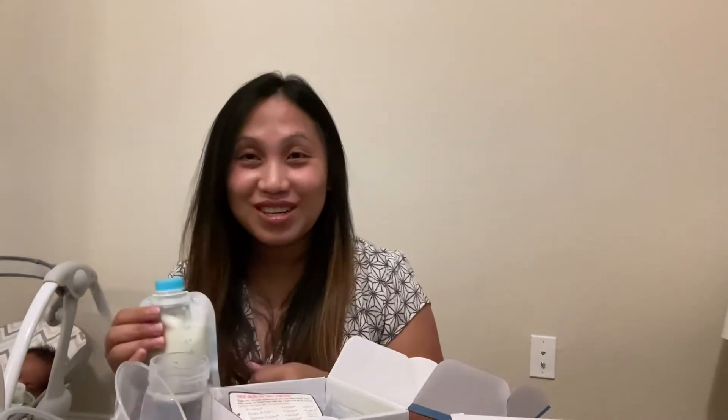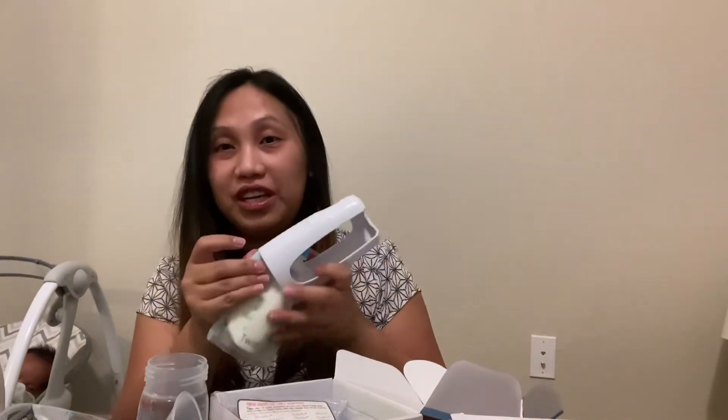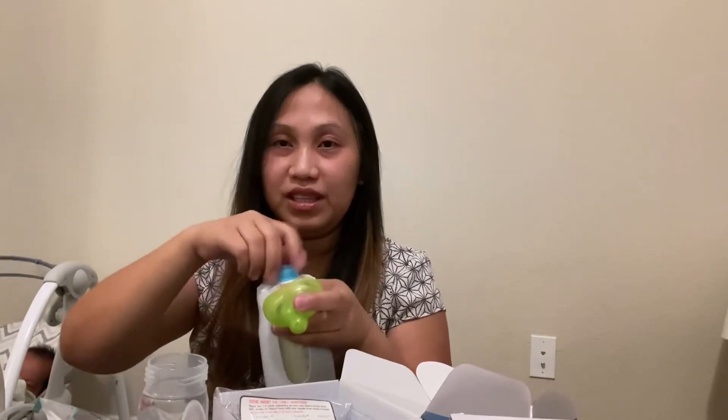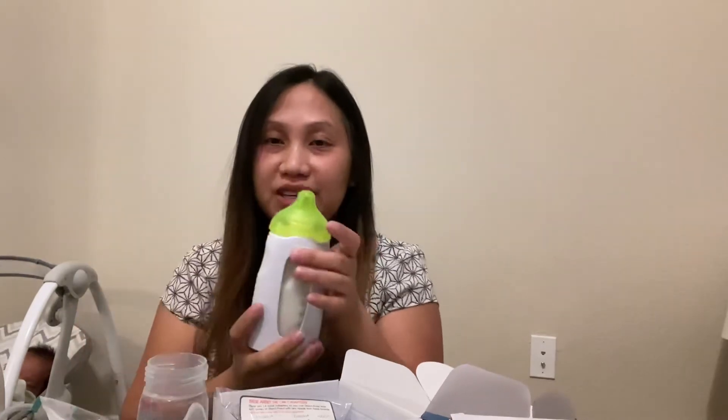You can attach this to a bottle and feed the baby that way. Or here's an even better idea — what's included in the box: you click this piece on, hear the clicking sound, open this cover, and they include a nipple. Put the nipple in and you're ready to feed the baby right from the pouch. See how easy that is!